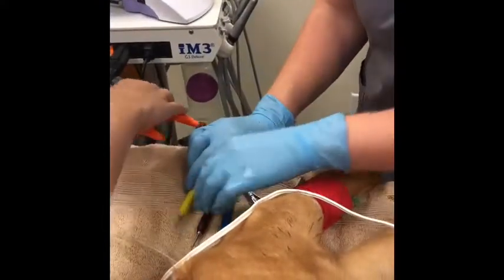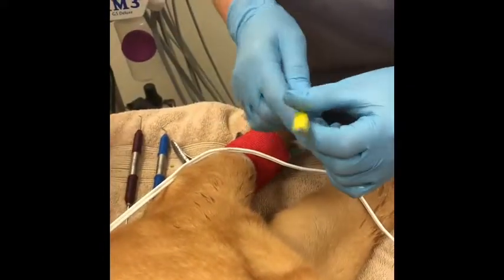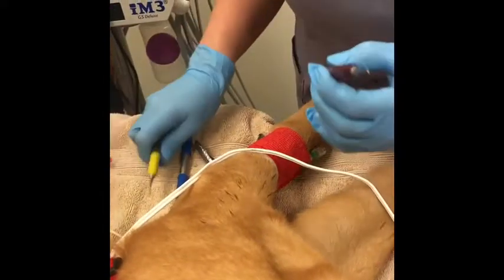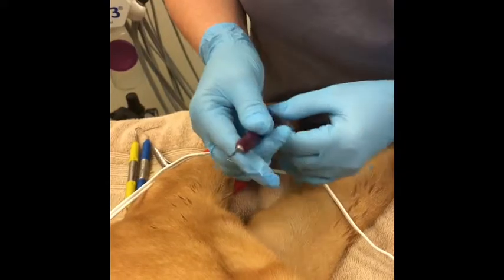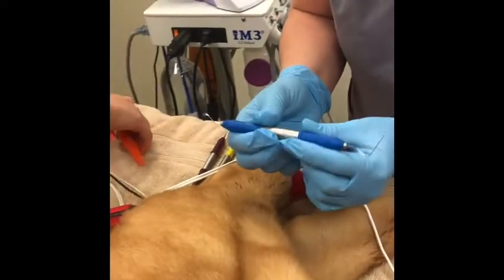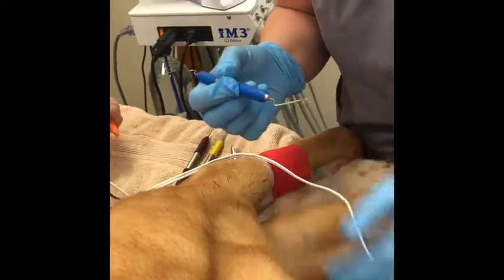We went ahead and got out our hand instruments as well. We have our curette, which is for underneath the gum so it doesn't actually hurt the gum. We have a hand scaler that's going to help us with all our difficult tartar. And then we have our probe and our explorer. The probe is going to be able to see if we have any pocketing or anything of the gingiva itself.